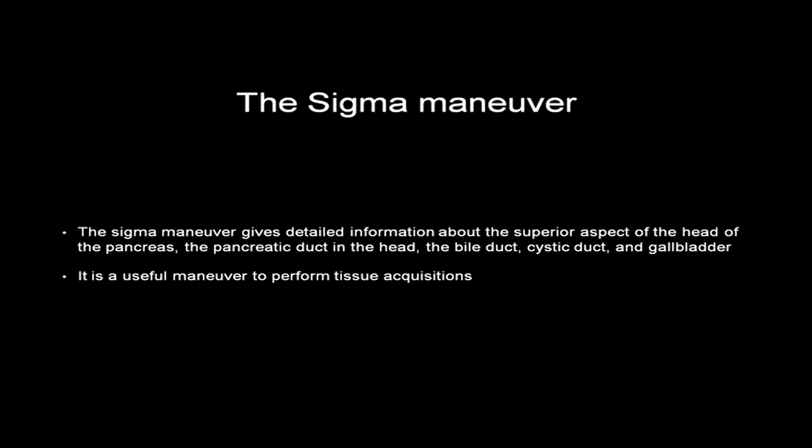The sigma maneuver gives detailed information about the superior aspect of the head of the pancreas, the pancreatic duct in the head, the bile duct, the cystic duct, and the gallbladder. It is a useful maneuver for performing tissue acquisitions in this region.